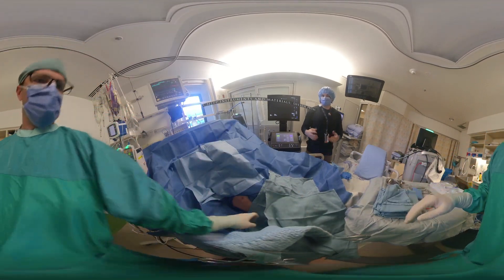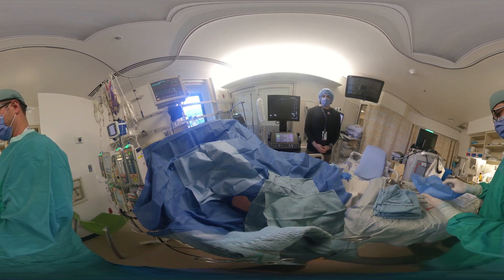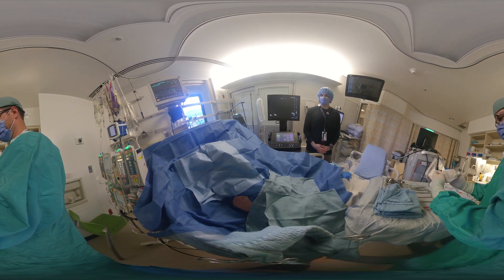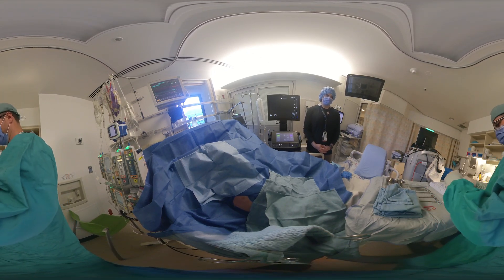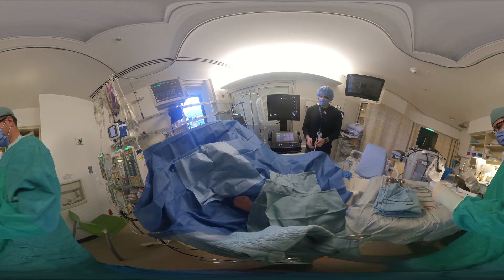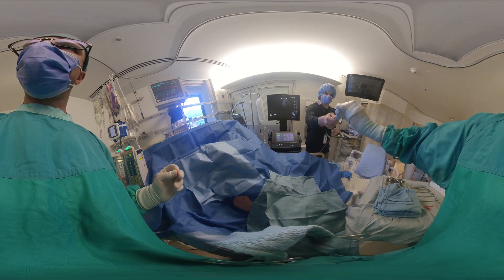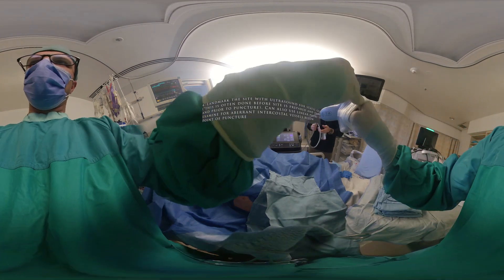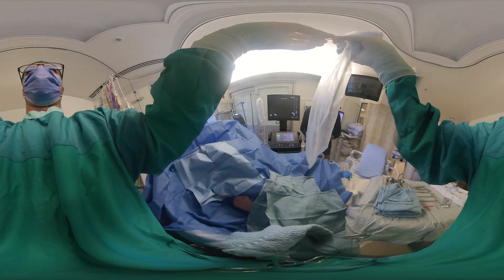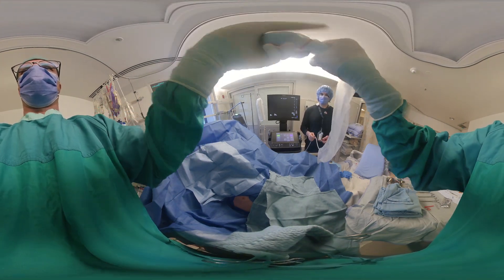Now we're going to prepare the ultrasound probe in this sterile cover to introduce it into the procedural field. I'm going to help you prepare the probe. You brought it there safely — perfect. Now just pull that sheath over and place the elastics on the probe to keep the sheath in place.